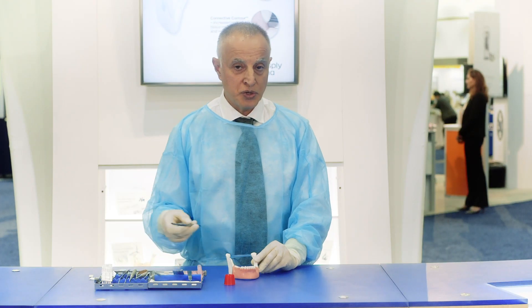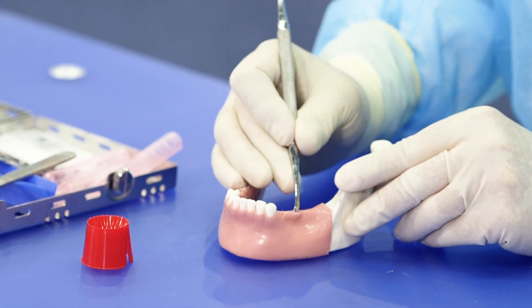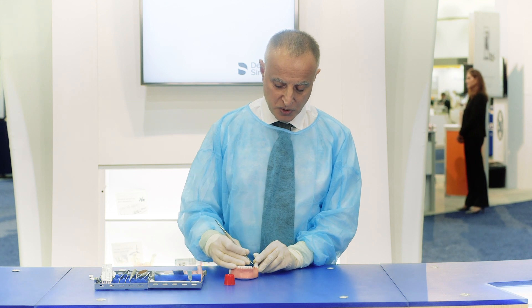Now we go on to using the periostal elevator and we gently elevate the tissue to fully expose the edentulous ridge.